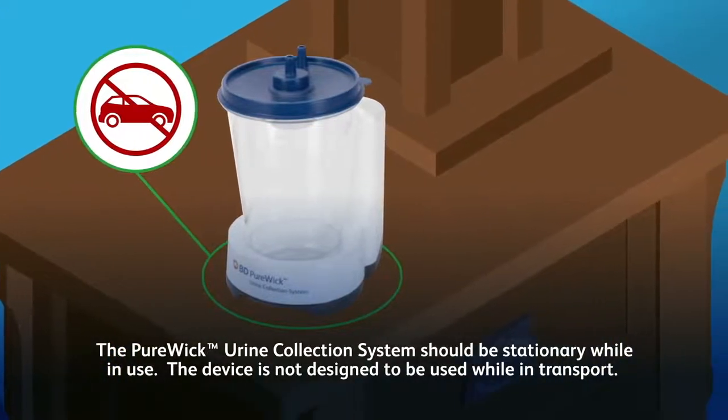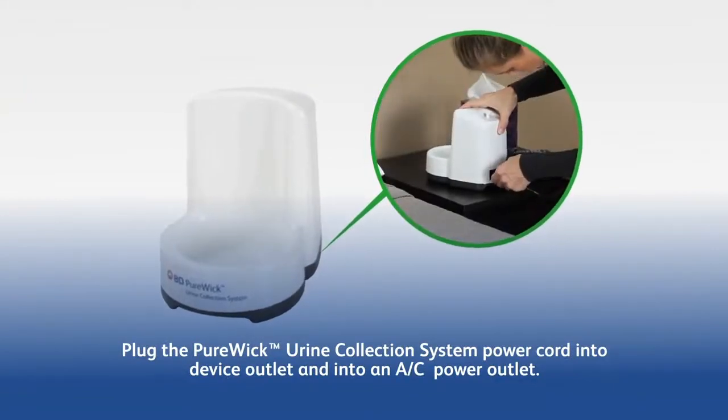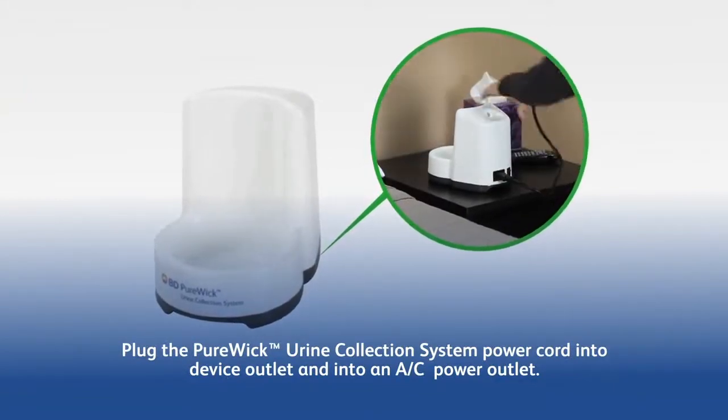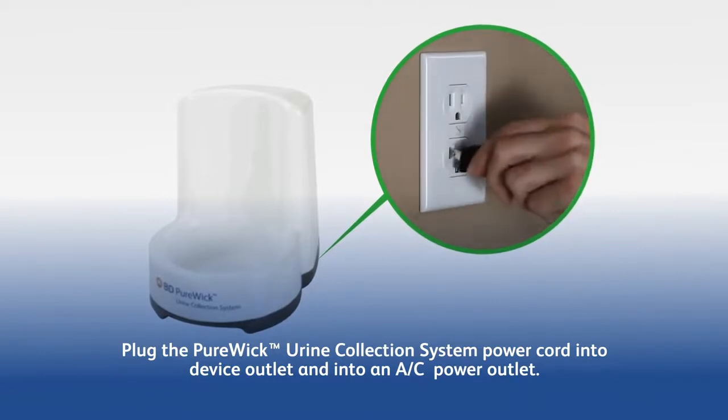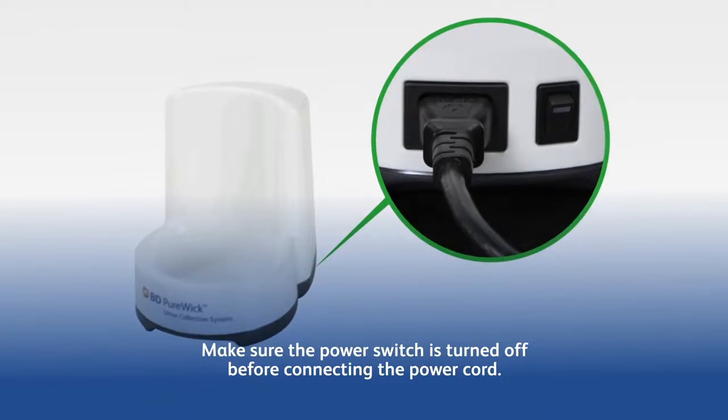The Purewick Urine Collection System should be stationary while in use. The device is not designed to be used while in transport. Plug the Purewick Urine Collection System power cord into the device outlet and into an AC power outlet. Make sure the power switch is turned off before connecting the power cord.